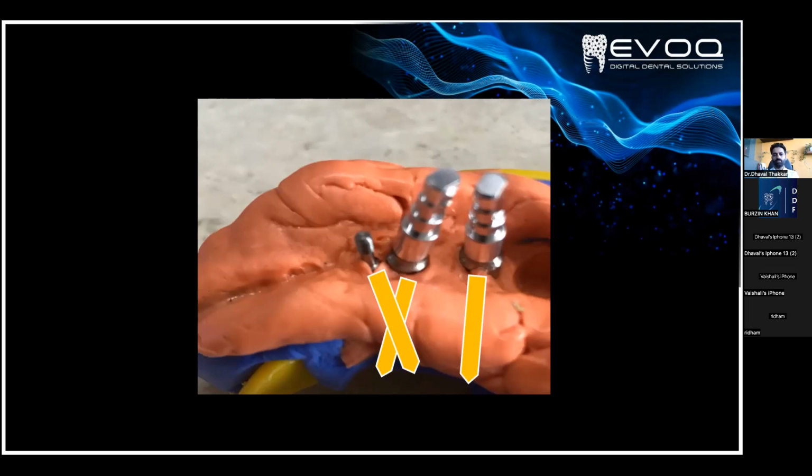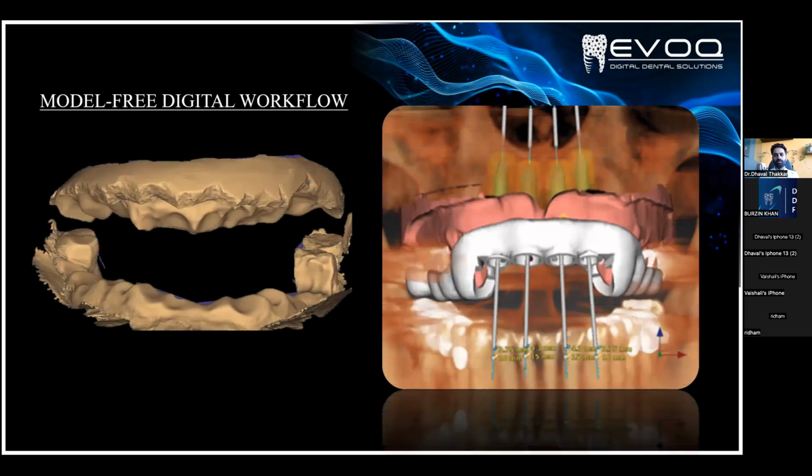But it is possible to do the scanning of the particular case by alternately placing the scan bodies. Similarly, we can make the 3D model and go ahead with the final prosthetic planning rather than compromising the whole case. So that's the model-free digital workflow.